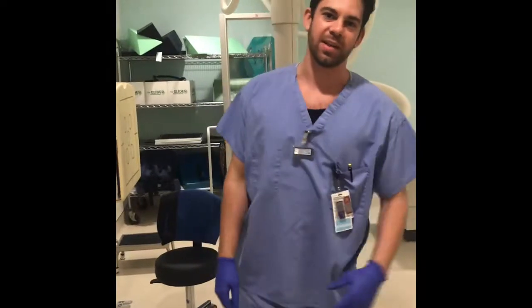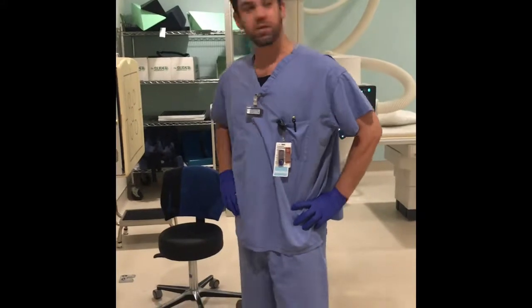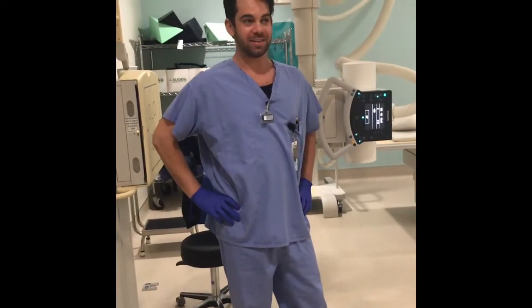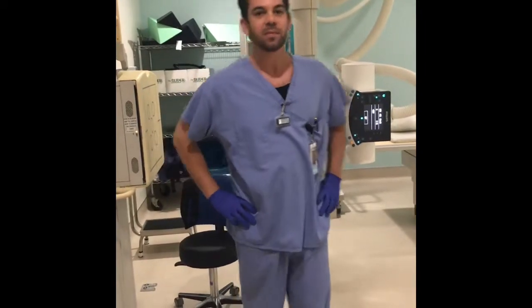Hi, my name's Jesse. I'm with SBCC, and today we're going to be doing a sinus x-ray. I've got 4 views that I'm going to do. I'm going to do a lateral, a PA, a parieto-canthal, and an SMV.